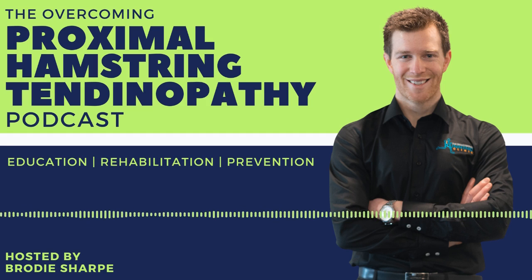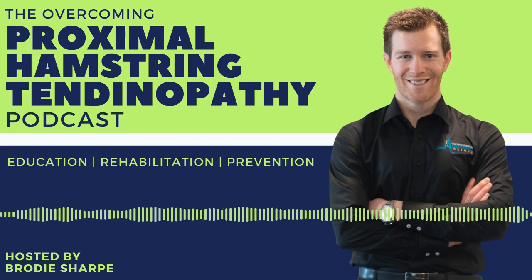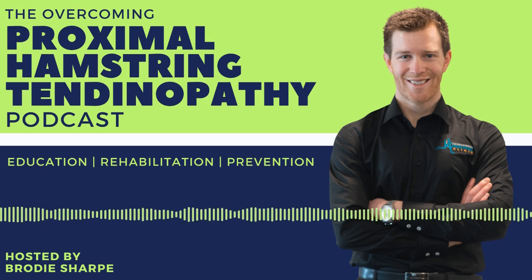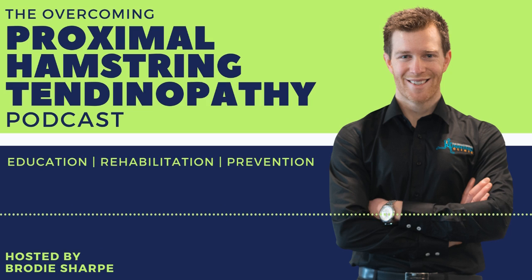Okay, so we're looking at those areas that you listed, and we're looking for a low level, achy, high functioning candidate who might be more suitable. Those who will respond less favorably would be those who come in with high levels of pain, just walking around, at an 8 or a 9, because like you said, shockwave therapy is designed to irritate things, and we can't irritate something that's already a 9 out of 10. Or someone who is very acute, who has really flared it up over the past week or so, and it hasn't settled down yet, and haven't sorted out other options that might be more effective. Yeah, perfect.